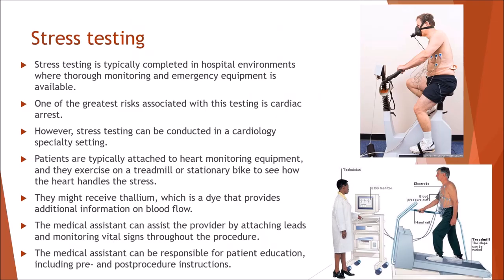Okay, now let's talk about stress testing. Stress testing is a test. It's basically an EKG that's going to be done while the patient is under stress. And there's different types. There could be a treadmill, which is the most common one. There's bicycle ones, and then there's others that are also done through drugs, where the patient cannot walk, where they give them some drugs, and it kind of mimics them doing exercise.